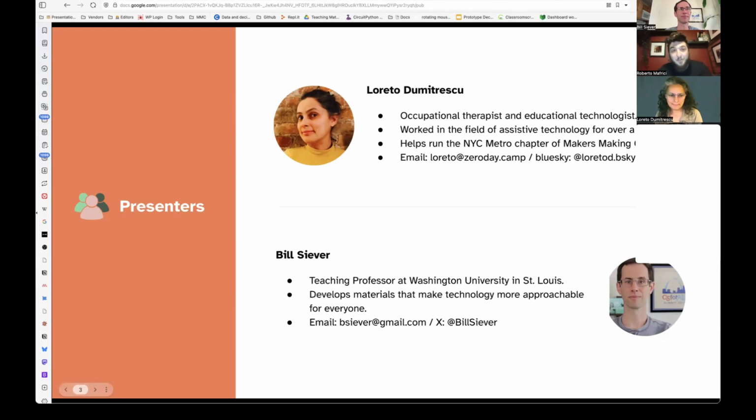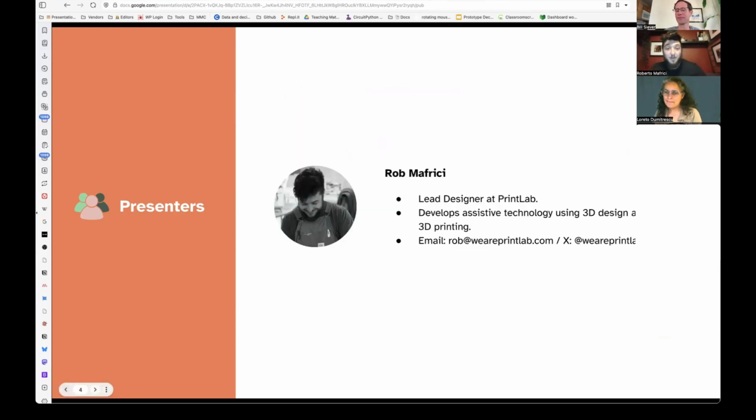Hi guys, I'm Rob Mafrici. I work as the lead designer at PrintLab. We work on doing 3D printing tutorials for schools and universities and makerspaces. My background is in product design. I got a master's in industrial design at Brunel, and I spent 5 years working in the toy industry, working for companies like Lego and Hasbro, prototyping and using a lot of 3D printing. And I've been really enjoying bringing that knowledge into the assistive technology space.